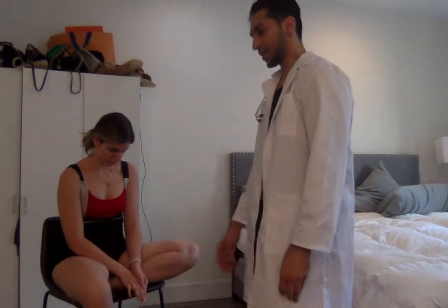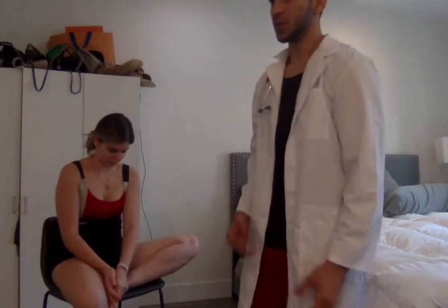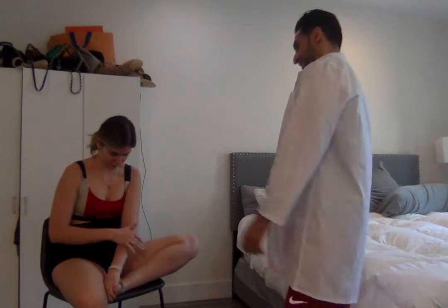Tympanic membrane was intact, pearly and gray. Pars flaccida was visible. No scarring, no perforation, none of that sort. No unidentifiable objects in the ears.